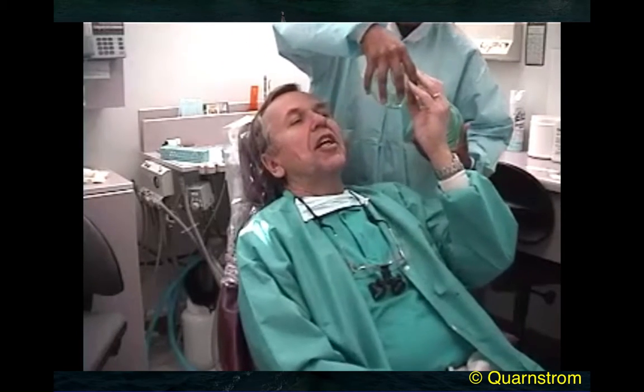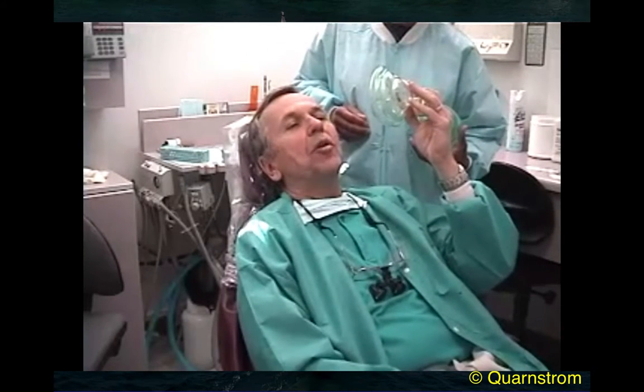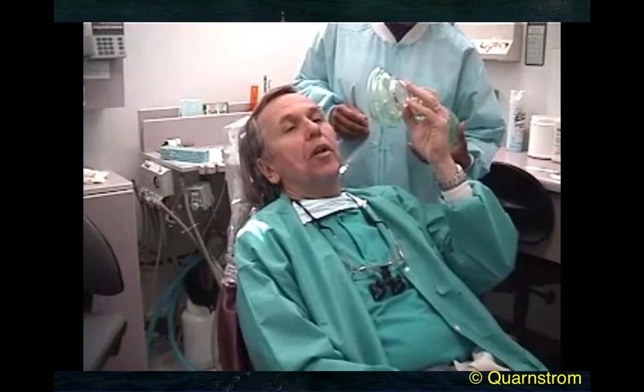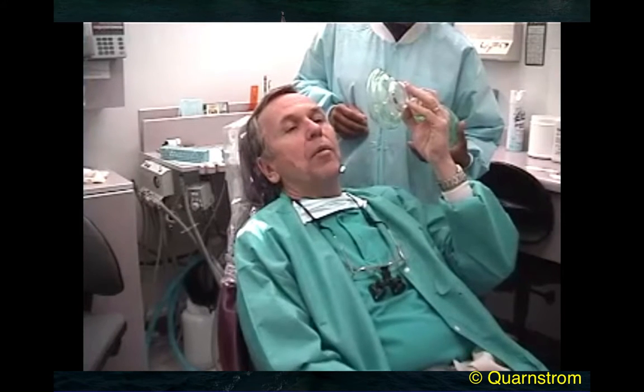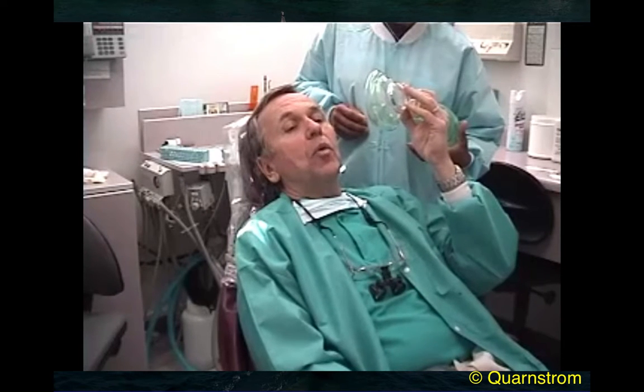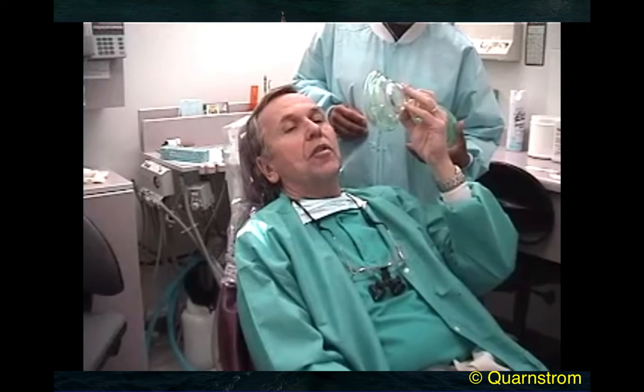And what I've just done there is put my face askew and created an air leak for her. Did you feel the difference? Did you feel a very definite difference? And I think it's important to do that, because your staff should feel how it is to try to breathe with an occluded airway, how it is to breathe when you've established a good airway, and how it feels when you have a leak. So I will do those three things for Essence now.